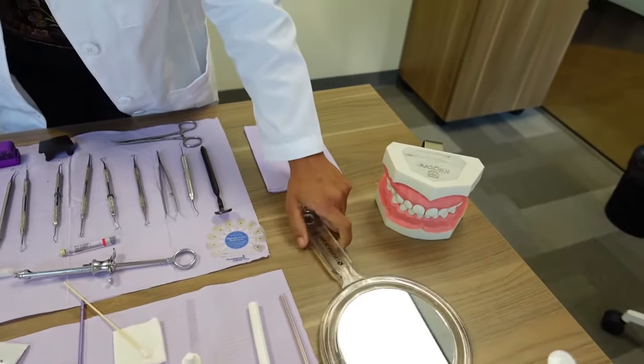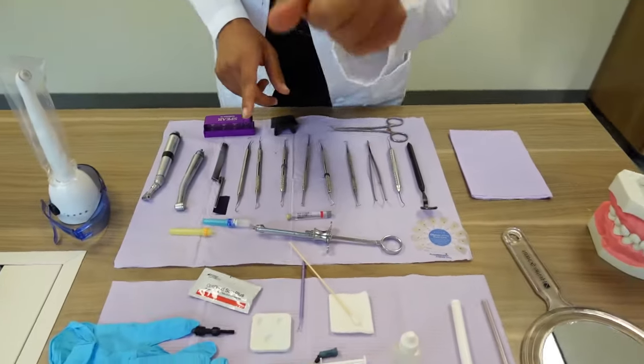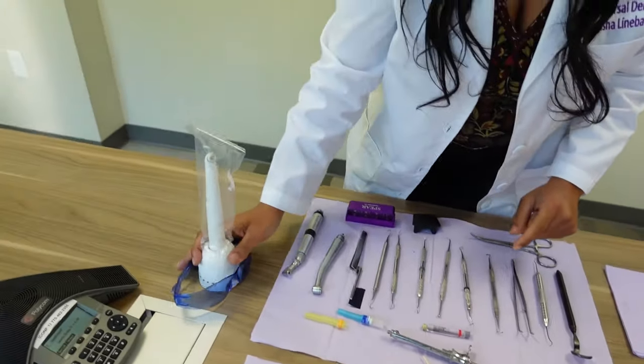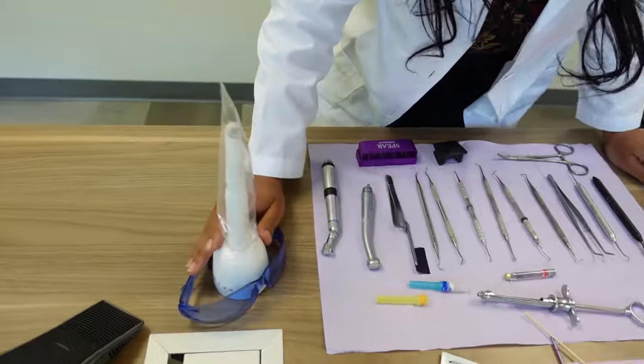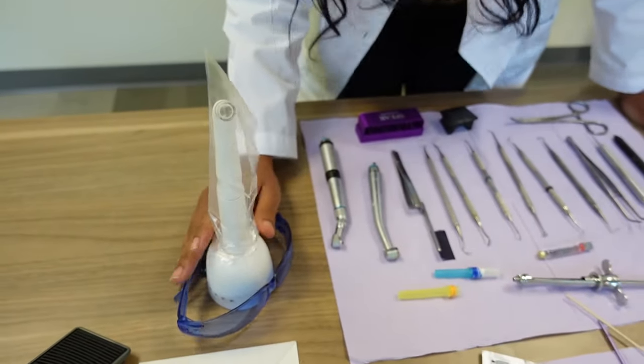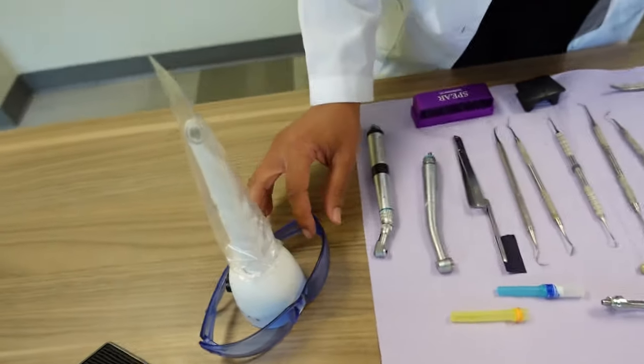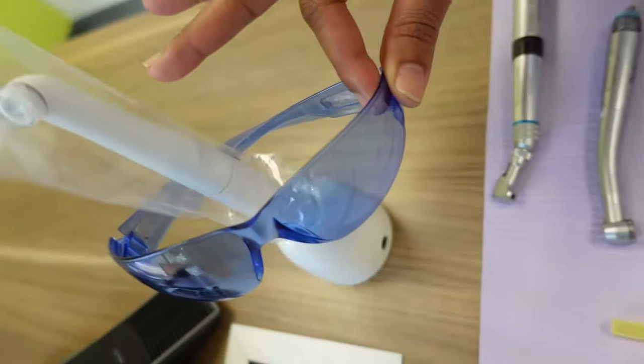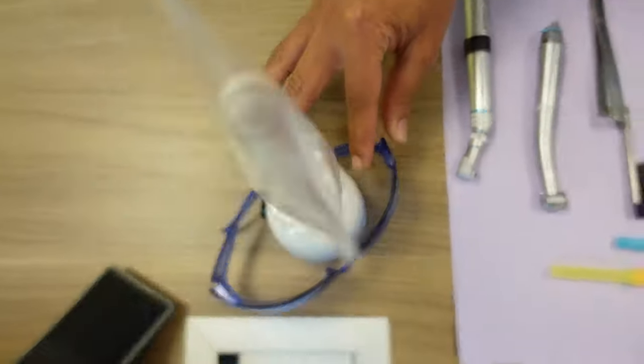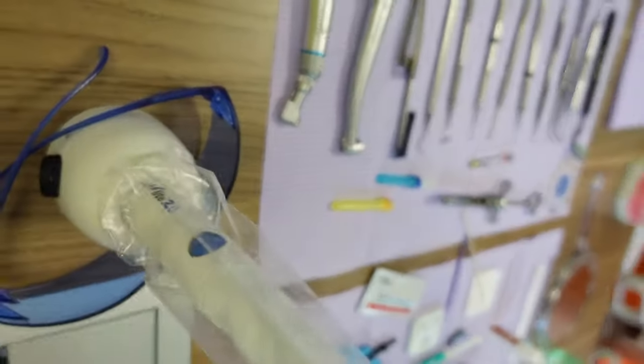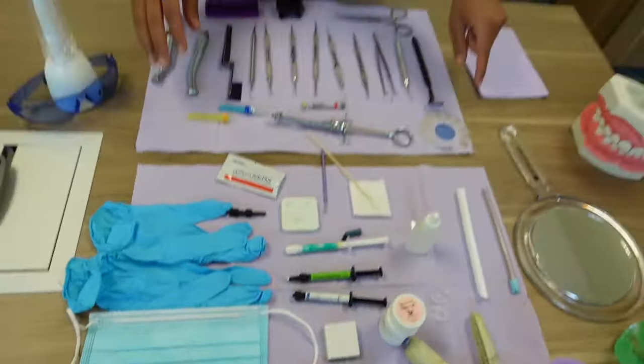Oh, hold on, one more thing—the light curing light. I forgot to mention that. Of course, you can't light cure composite without a light curing light. So this is the light curing light right here, and these are the glasses that you put on to protect you from the UV light.